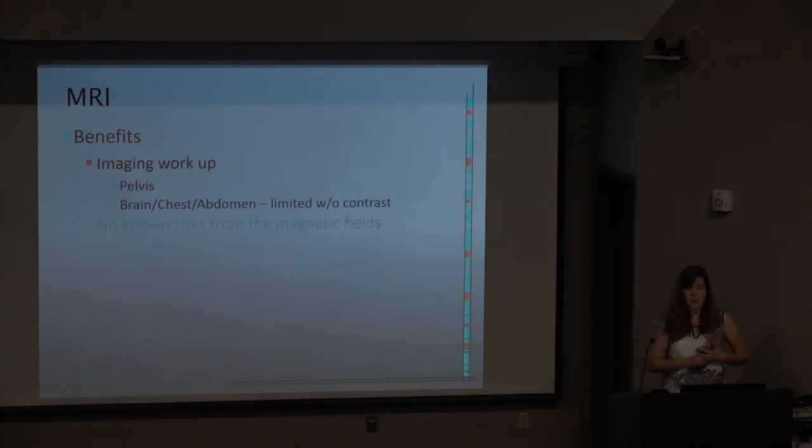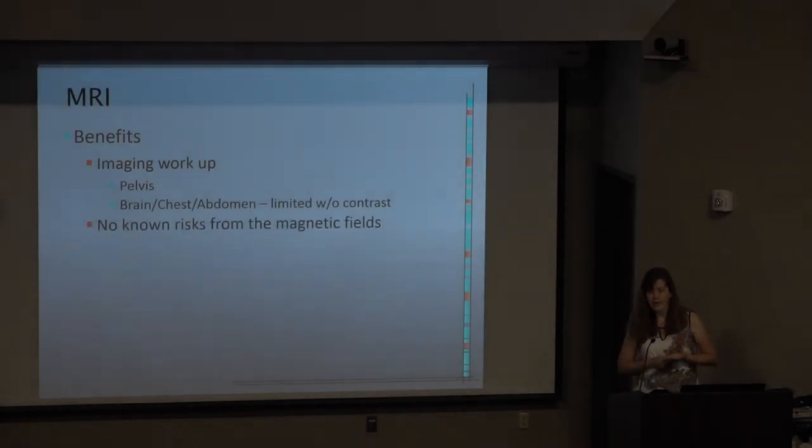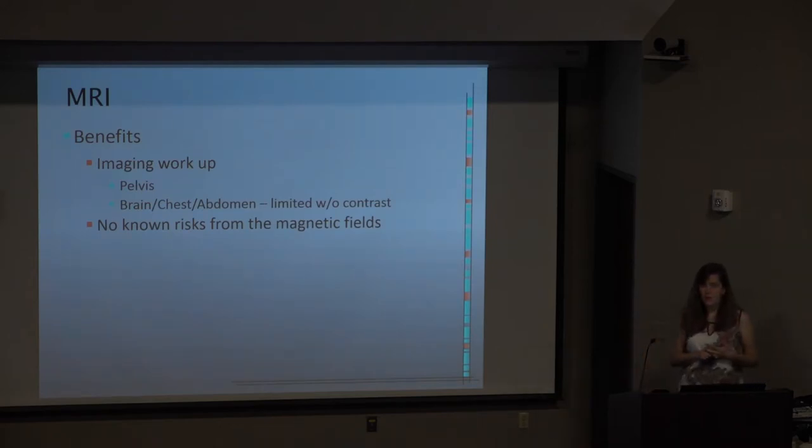So moving along to MRI. MRI is a newer modality. It's available and usable and gives you good information, I would say, in tertiary care centers. I think if you're practicing out in the community in smaller centers, MRI is not always as beneficial because they have older machines and older technology.